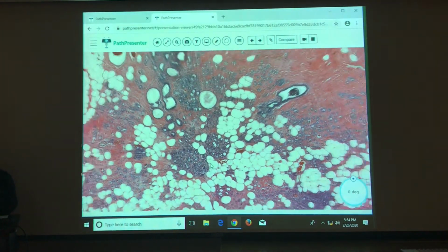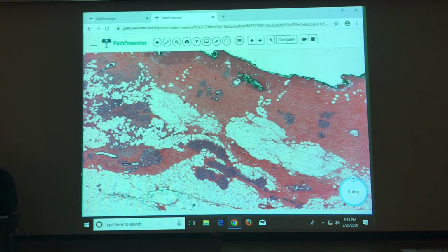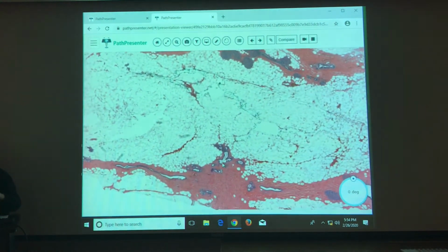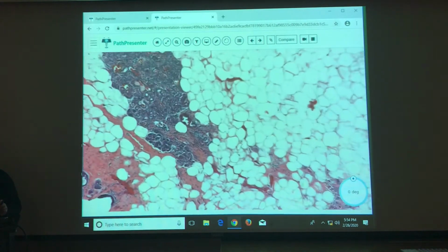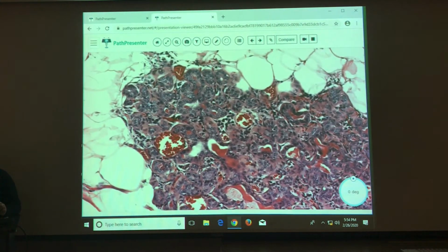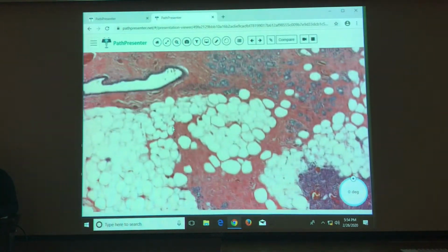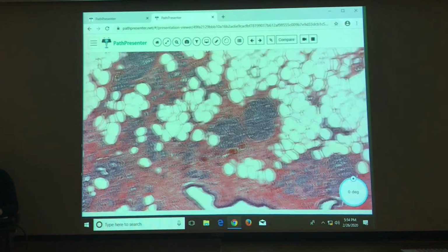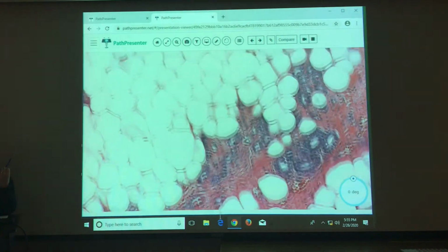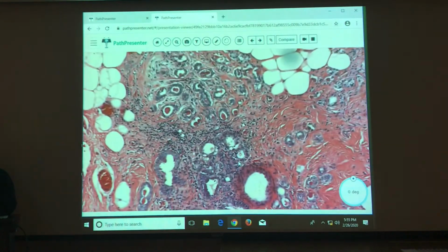I think this is a pretty classic case. You can see things like chondroid metaplasia, but often these things are just presenting for incidental findings. If they're very indurated, they could be biopsied or excised for a mass lesion. But if you see this on biopsy, or let's say a lumpectomy, and it wasn't entirely submitted, you have to go back and submit the rest of this.